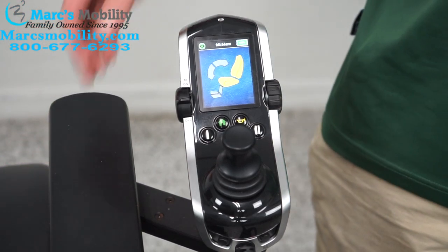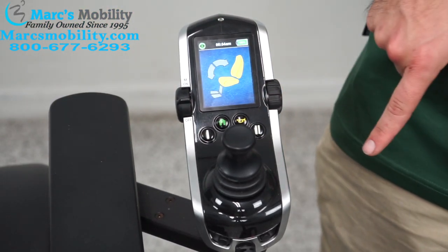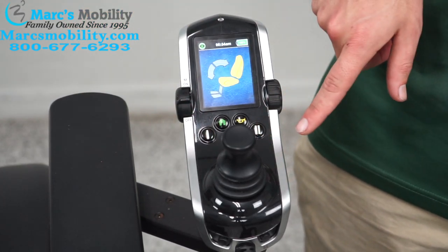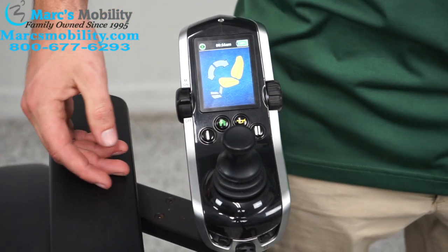To access the function menu directly, press button 2. So remember: button 1 goes back to indoor slow, and button 2 will always take you to the function menu. The yellow button is your horn.